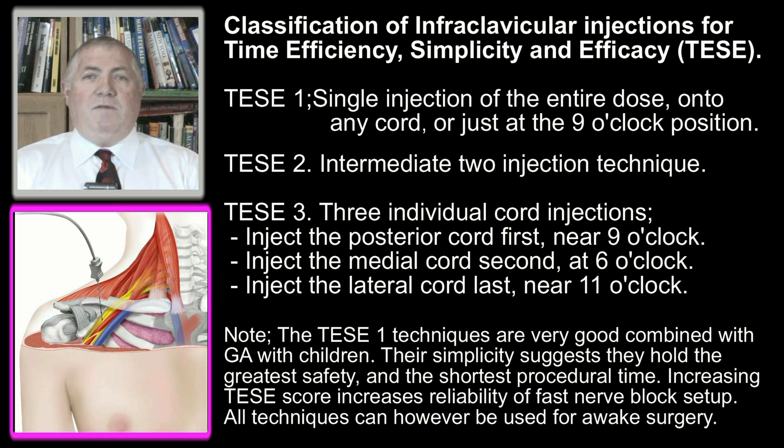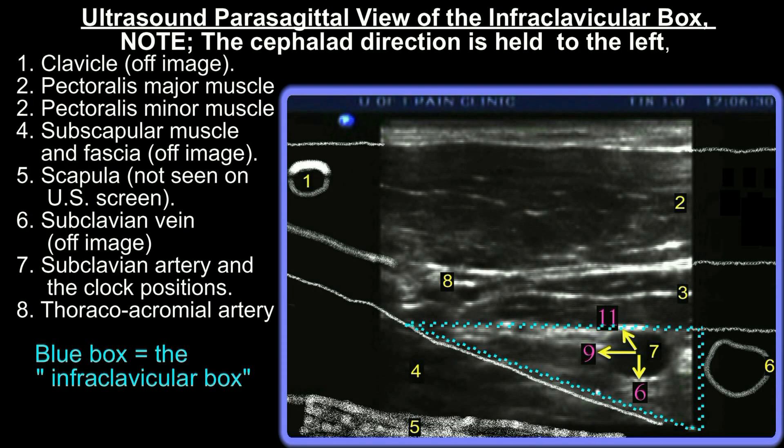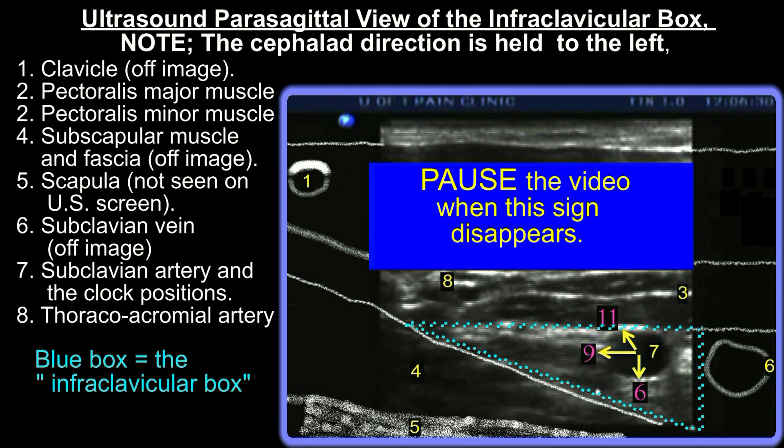An injection made visually guided only at the 9 o'clock paravascular position of the subclavian artery will be highly successful. We recommend verifying precise needle placement using a nerve stimulator as well. The very fastest infraclavicular block onset is achieved with a three-cord injection at the 6 o'clock, 9 o'clock, and 11 o'clock positions about the artery. This will give a donut-shaped drug spread around the artery.